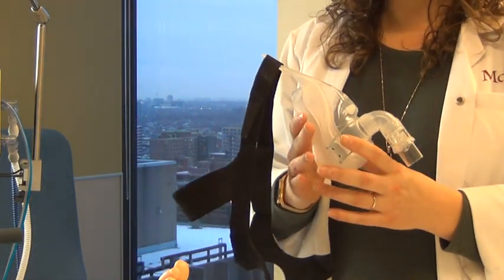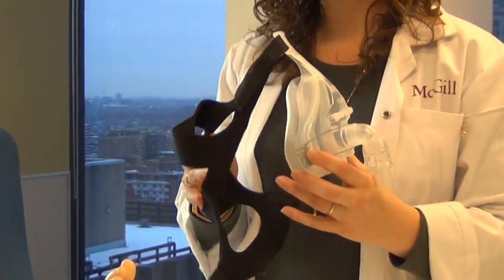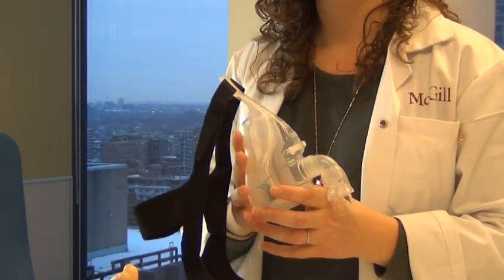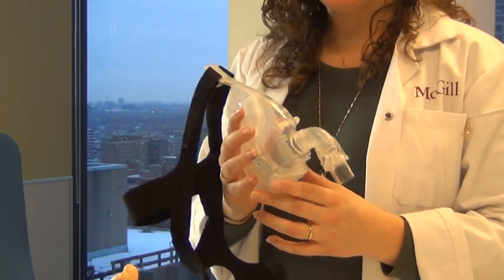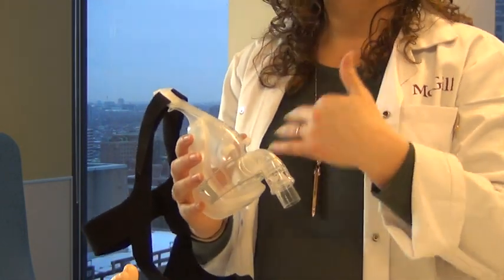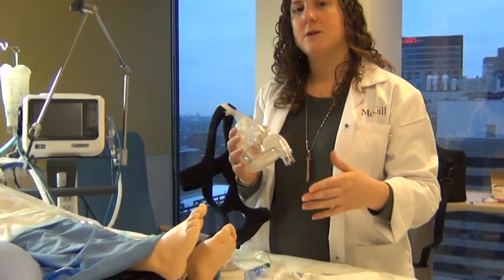So what it does is that it's a way to support our patients. A lot of times patients with COPD will find themselves with this type of ventilation before they get intubated, just because of the risks and the difficulties of extubating these patients. But this provides them with positive airway pressure to help push air into the lungs. If they have a lot of work of breathing, it will decrease that work of breathing. And it also ensures that on exhalation they do not obstruct.